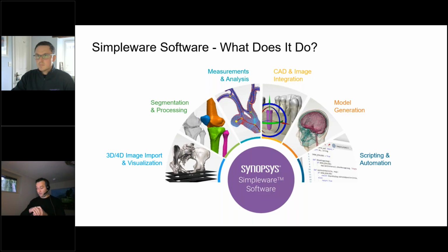As the company grows, we like to grow with them and help support that growth. For companies to grow, segmentation and image processing tends to be a bottleneck, and we have tools and automation capabilities, everything from off the shelf to fully customized solutions, to help people scale that workflow, to go from say 2 patients a month to hundreds or thousands per month.